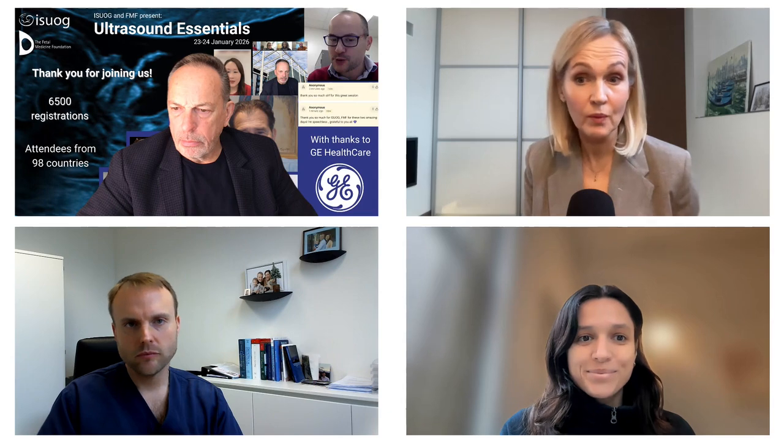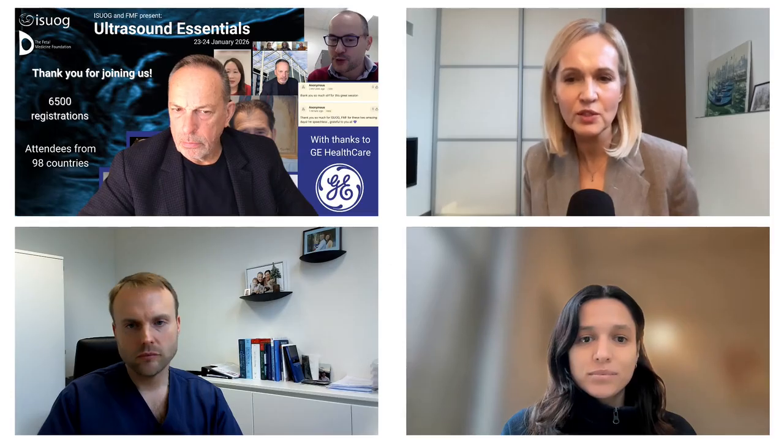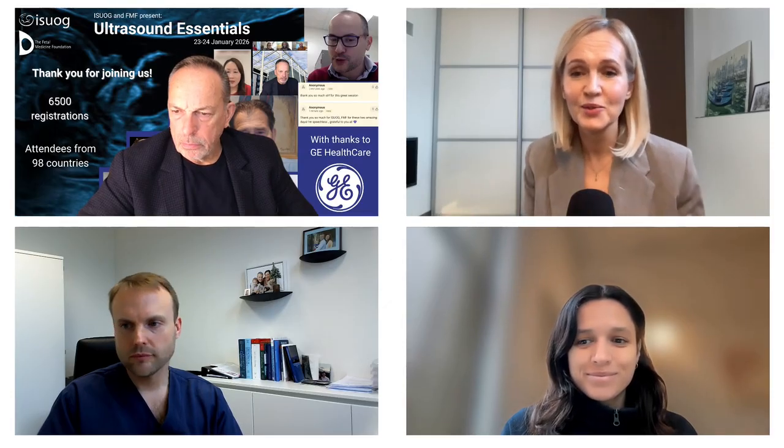Okay. Thank you. And we have one more question, and I believe it's interesting. It looks naive, but it's a very practical one. Probably for Nina, I don't know if you don't mind. Sometimes the loculation of an inclusion cyst can't be differentiated from a suspected cystadenoma. What is the next step?